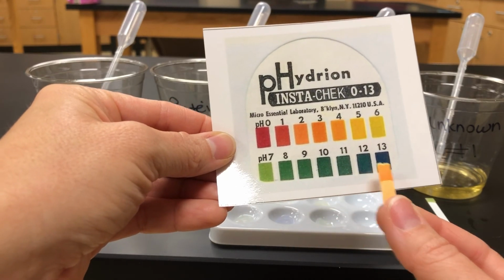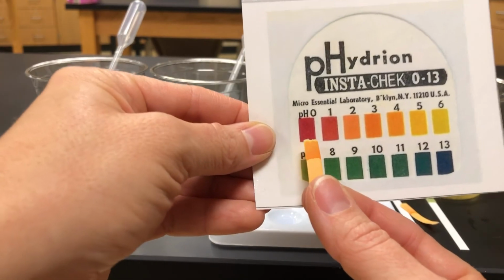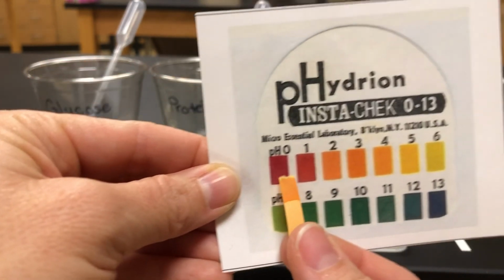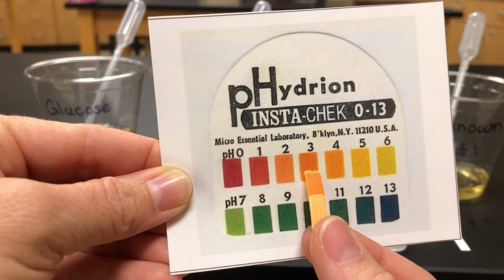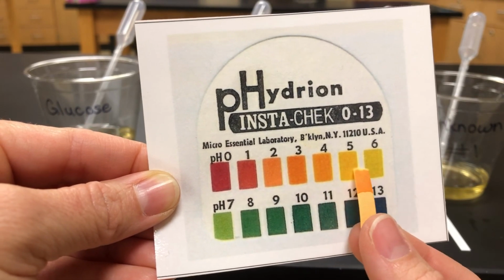Pretty sure we're not going to choose any of those, so we'll go back up to these ones. Maybe get a little closer if we can. That's kind of tricky, huh?